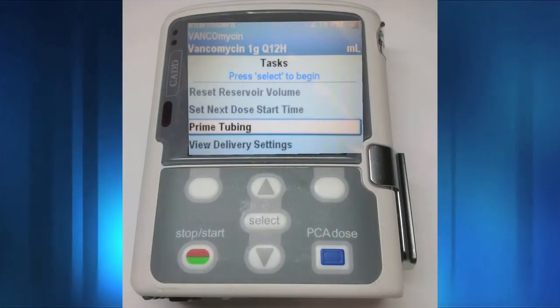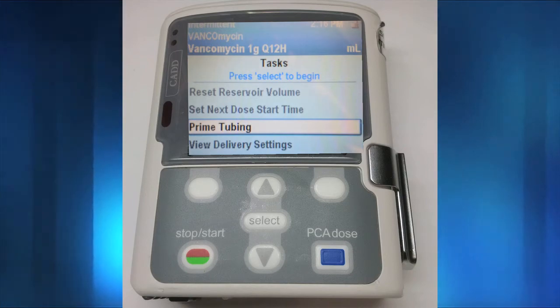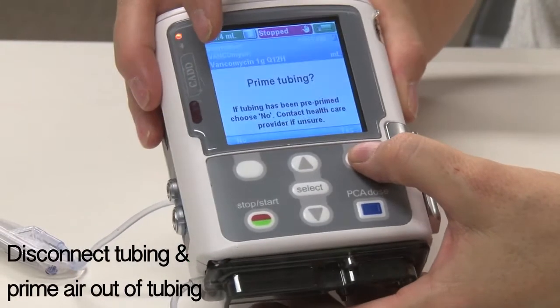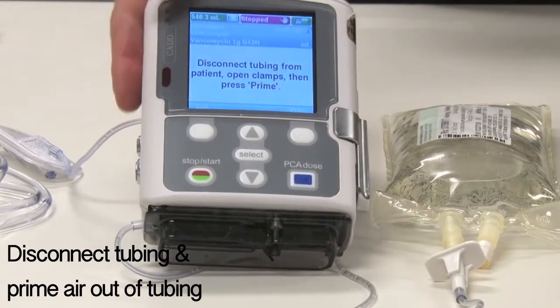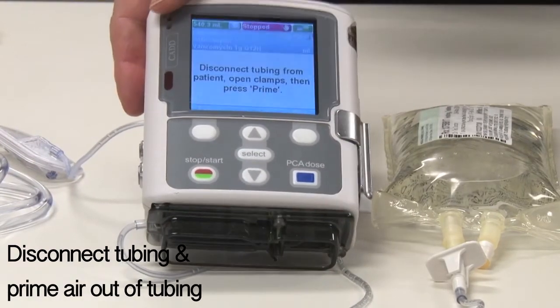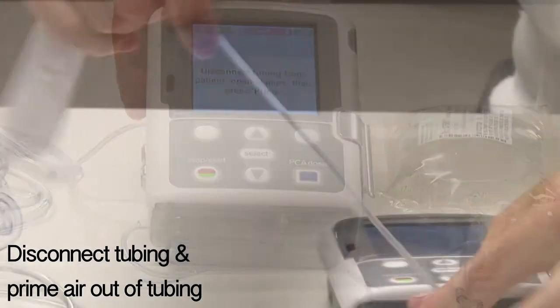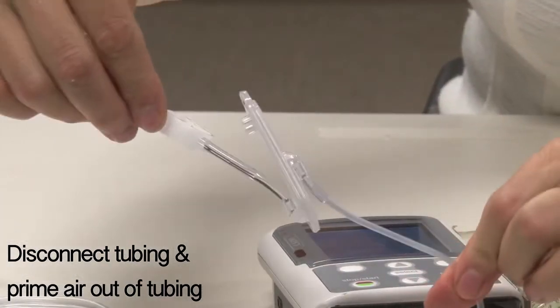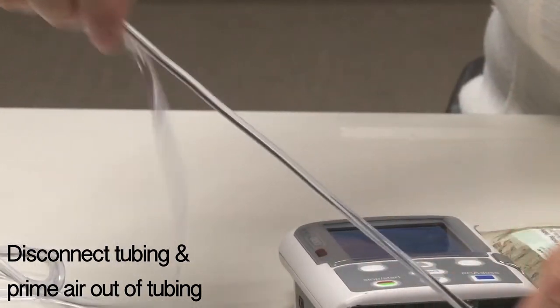If the pump does not display 'prime tubing,' press Tasks, then Prime Tubing, and then Yes to prime tubing. Close the clamp, disconnect the tubing from the patient, open the clamp, and select Prime until all of the air is primed out of the administration set. To prevent air embolism, ensure that the entire tubing is free of all air bubbles before connecting to the patient.